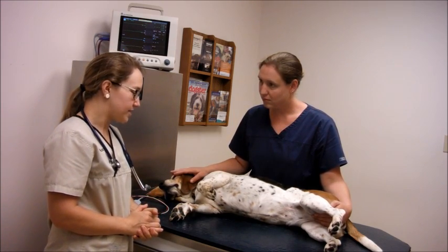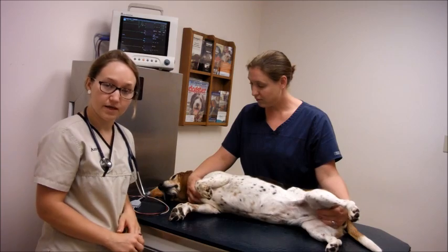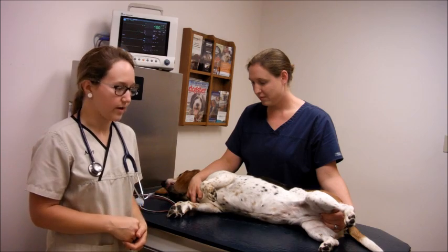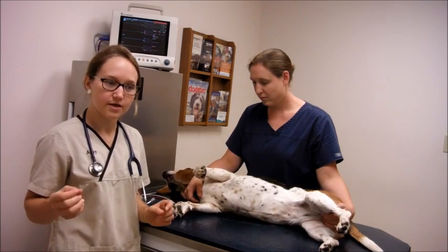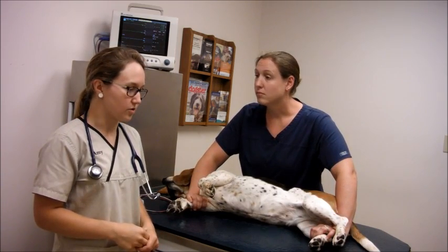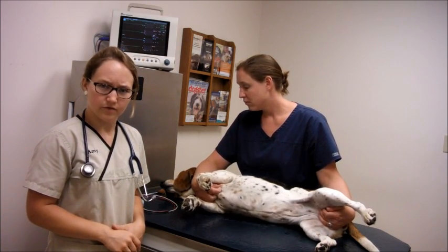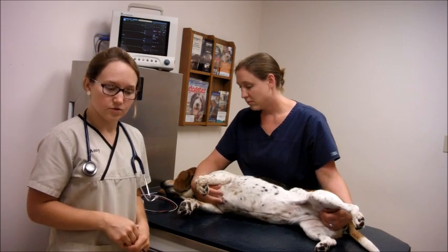ECG stands for electrocardiogram. This is measuring the electrical impulses that are given off by the heart when it beats. I'm going to have three leads on her, and as the leads are on her, they'll collect the electrical impulses from her heart and send them back to the machine, which will process and display heart complexes. Those complexes consist of P, Q, R, S, T, and U waves. A lot of dogs have a normal sinus arrhythmia, so it's possible that the complexes will go with the way she's breathing.